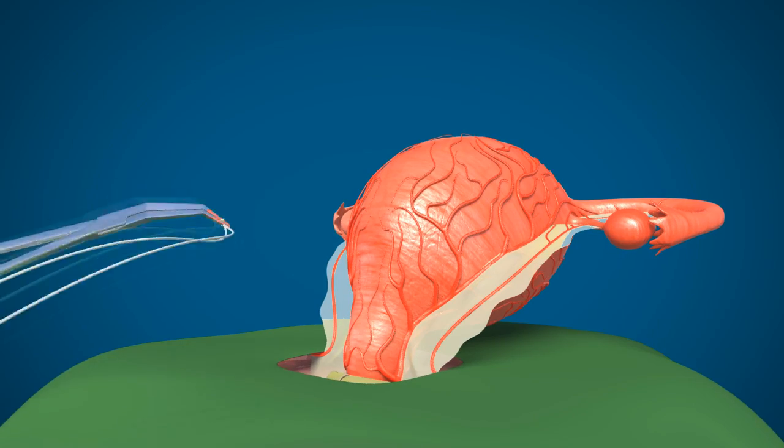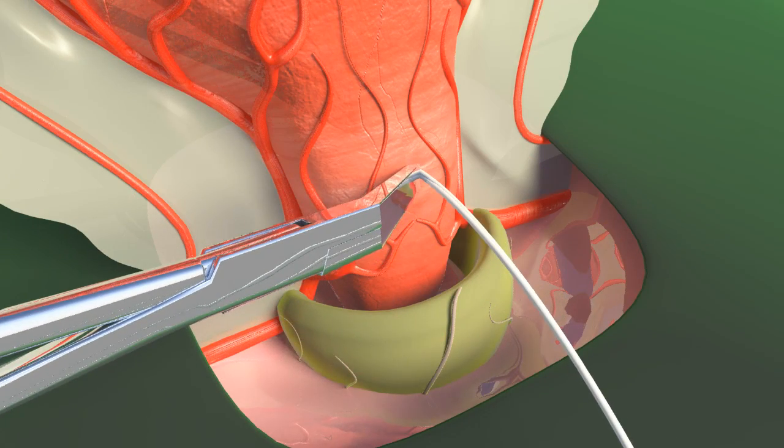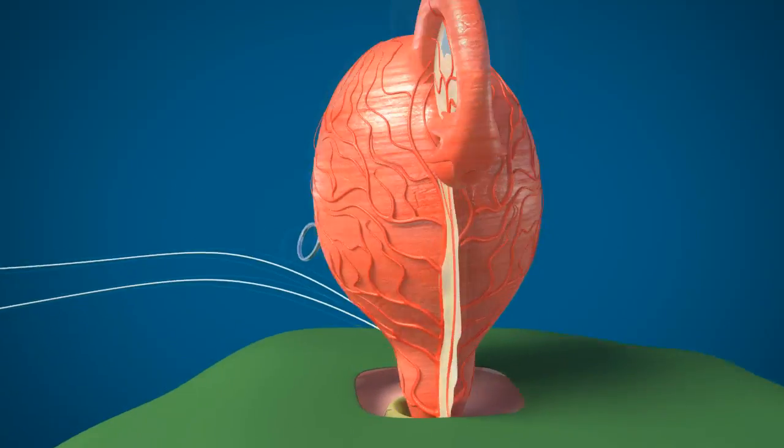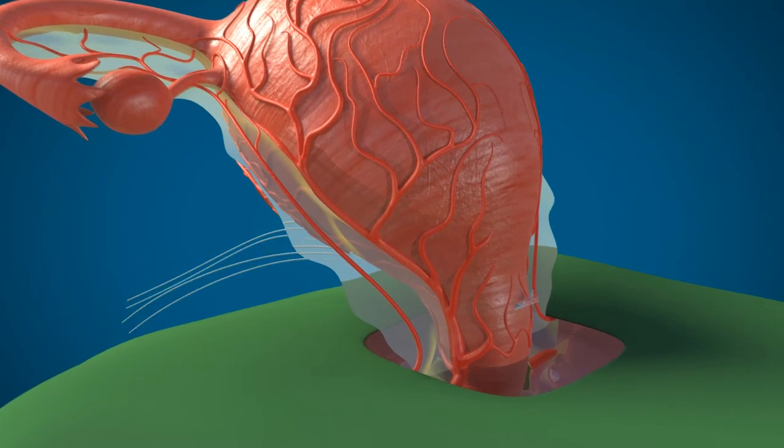Two pieces of No. 1 Vicryl, 50 cm in length, are taken at the tip of the PUL forceps and it is passed from anterior to posterior side, just above the bladder at the center of the cervix, to reach the posterior side like this.